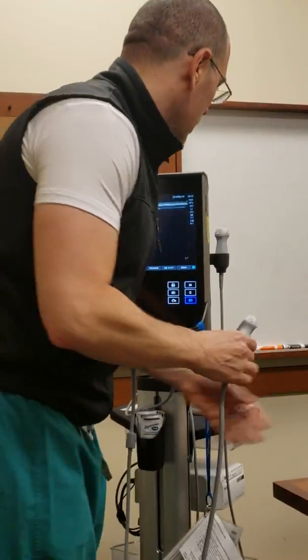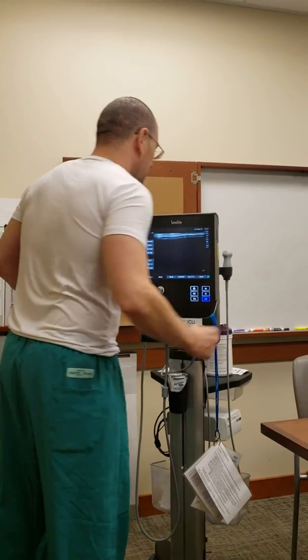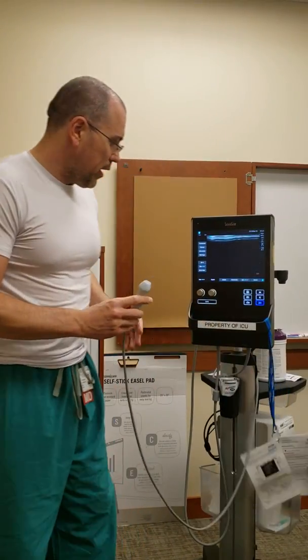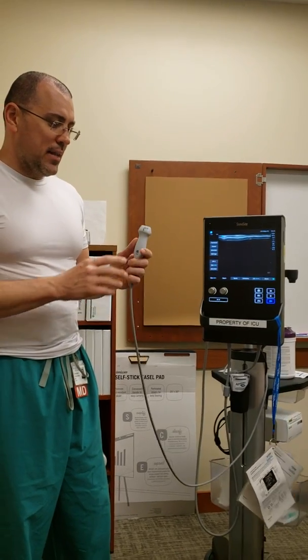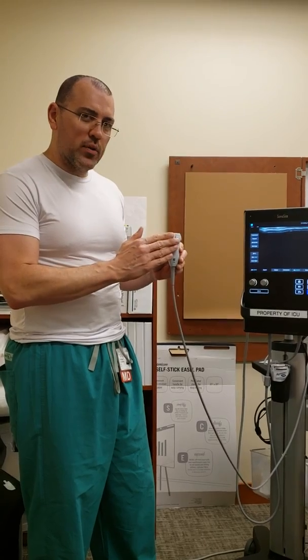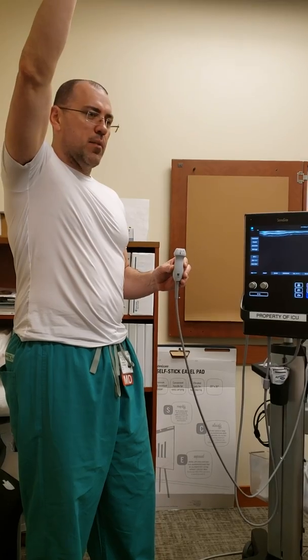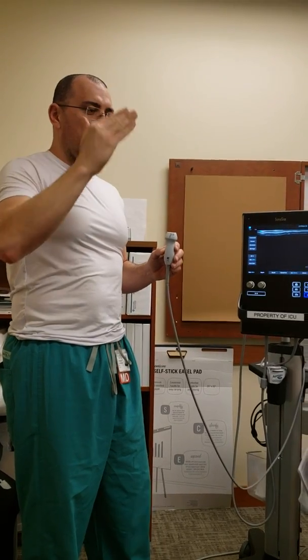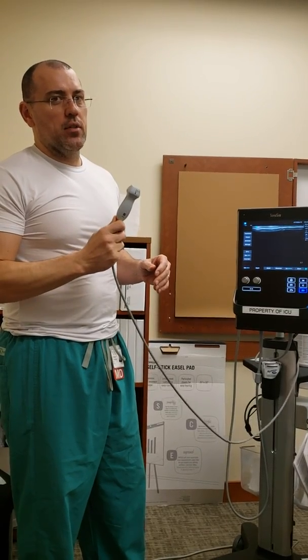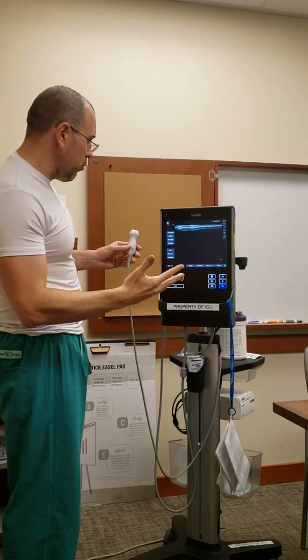The other probe we use is the cardiac probe. The cardiac probe also has a piezoelectric crystal inside, but this is a low-frequency crystal. Since it's low frequency, the image can go much farther — like 20 or maybe 24 centimeters. But since you're going so far, you lose resolution. This probe is used for cardiac examinations only — never use this probe for lines.